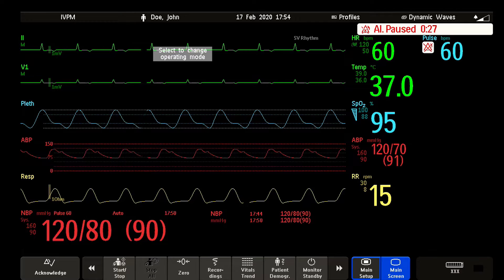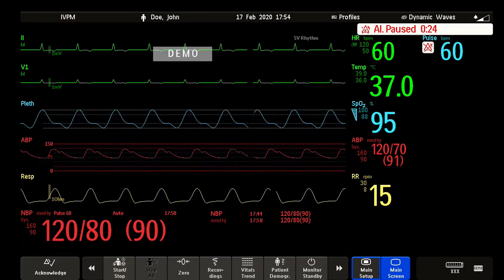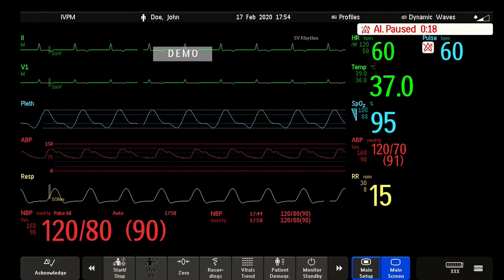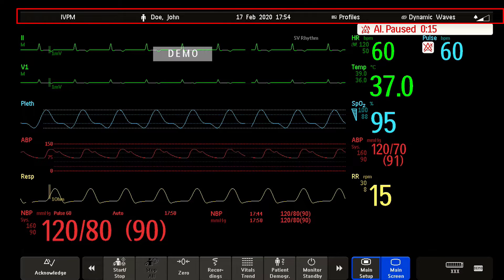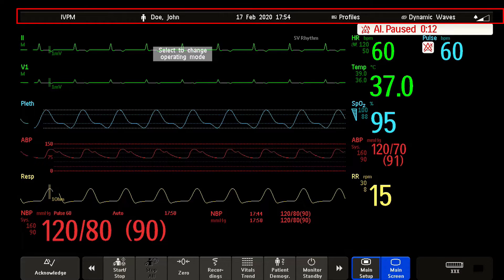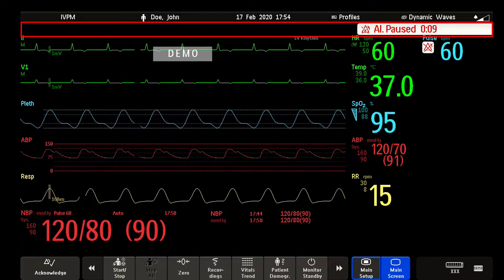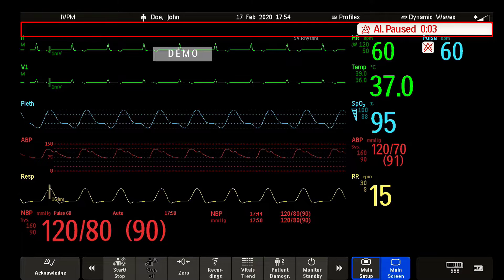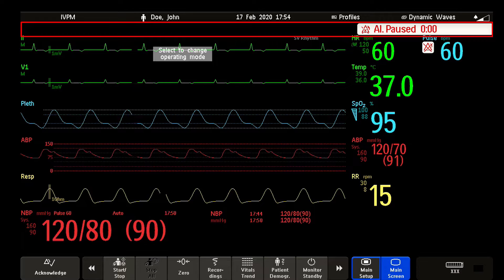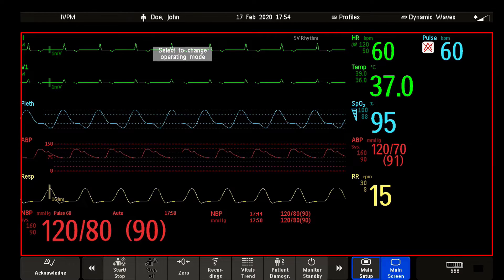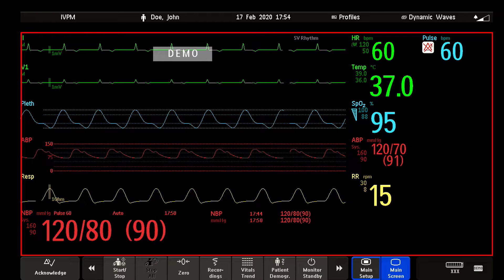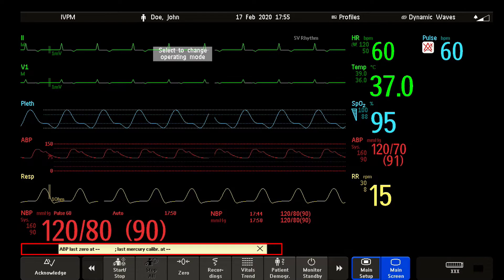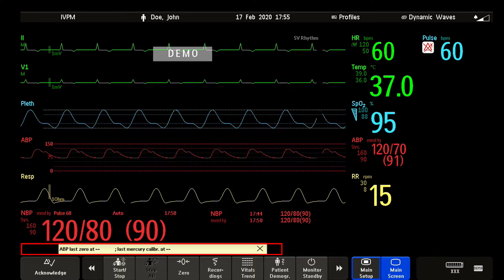You are viewing a screen of an Intelliview Patient Monitor displaying data in demo mode. The screen is made up of different areas. This is the monitor information line, displaying amongst other things the patient name. The alarm status area shows active alarm messages or alarm symbols when all alarms are switched off. The measurement area displays the clinical measurement values, the waveforms, trends, and clinical applications. The status line shows messages with information and prompts you for possible actions.